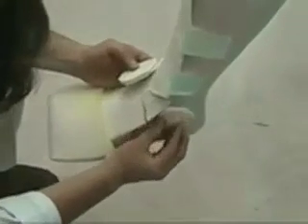We are now nearly finished with our initial aspect of the contact cast, which is the precast area. We will then apply some adhesive felt to the medial and lateral malleoli to protect them. This is what we have prior to our application of the contact cast.